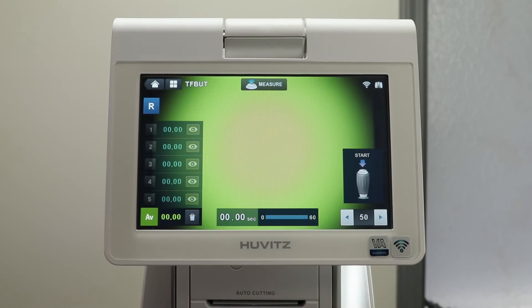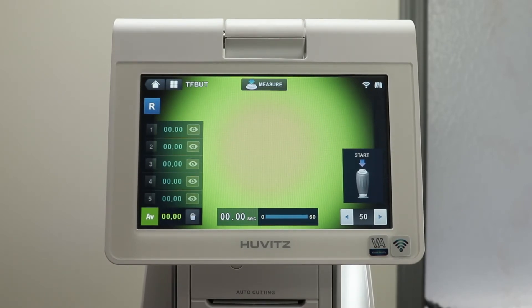In tear film breakup testing, you will use the joystick to start and stop your timer. With the help of fluorescein dye, you can use up to five measurements to get an accurate average tear film destruction time.